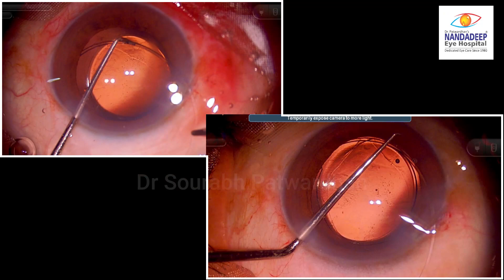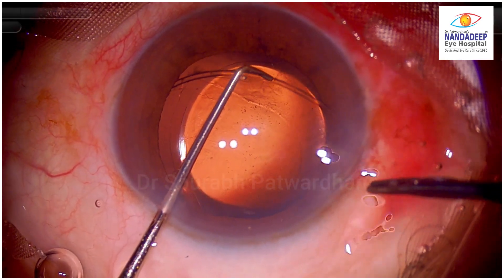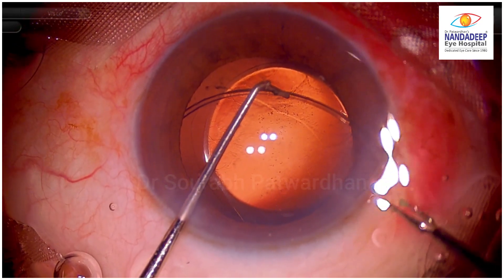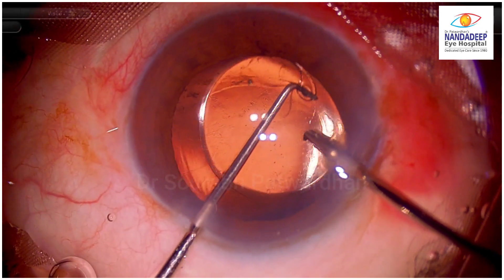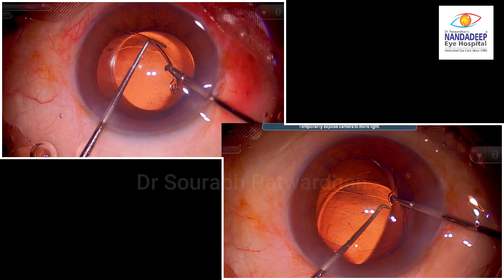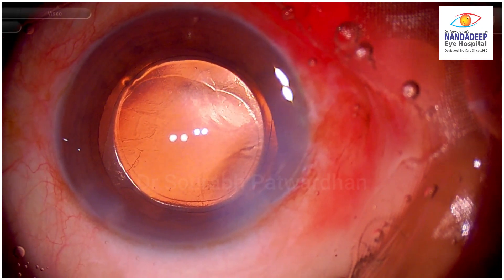So that is the difference in the position of the dialer. The left upper position is the right position where the CTR is being guided into the bag — not just pulling it centrally but also pushing it a little bit down. As we come to the last part of the CTR, watch — I am holding the CTR not at the eyelet but just proximal to it using the forceps, and then I am going to hold the eyelet with the longer Sinski hook and then gently guide the CTR into the bag. Holding it with the Sinski at the end gives us the chance to rotate it inside the bag if we wish to position it correctly.